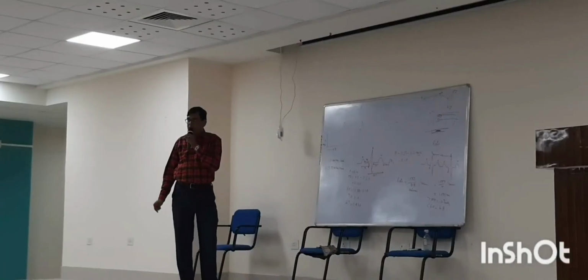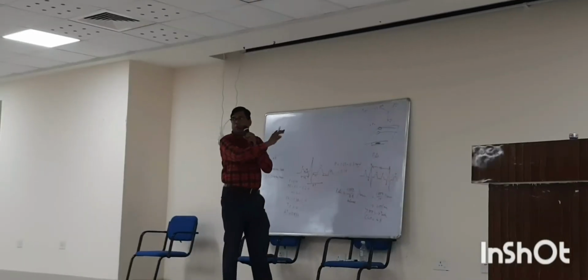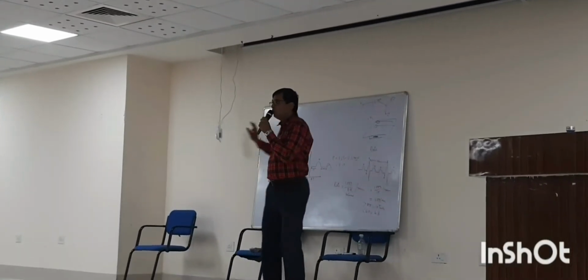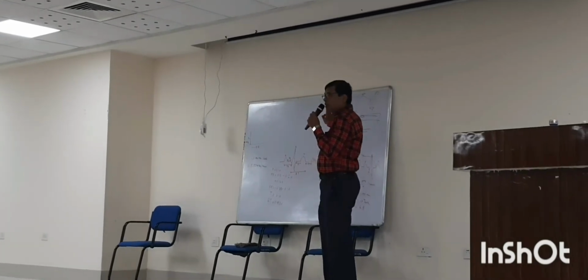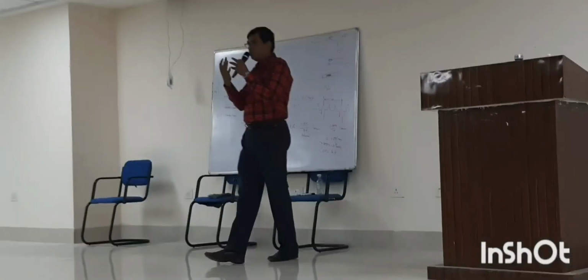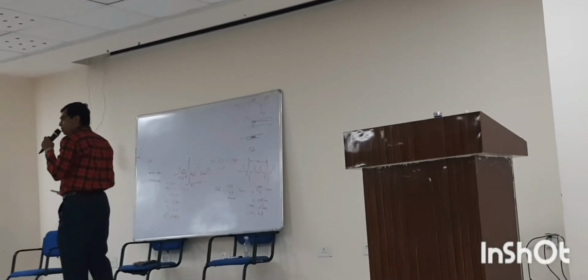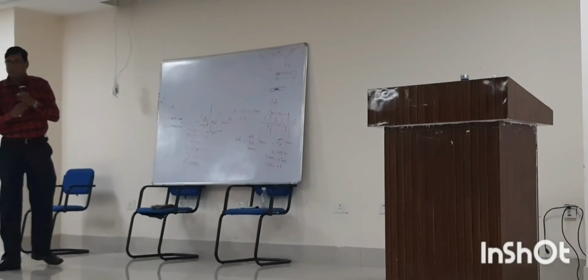Now go to the axis and the mean electrical axis. What will be the axis? These two, look at the board, are the triaxial reference system. If we combine these two, it will become the frontal plane hexaxial reference system. So I am going to draw the hexaxial reference system.